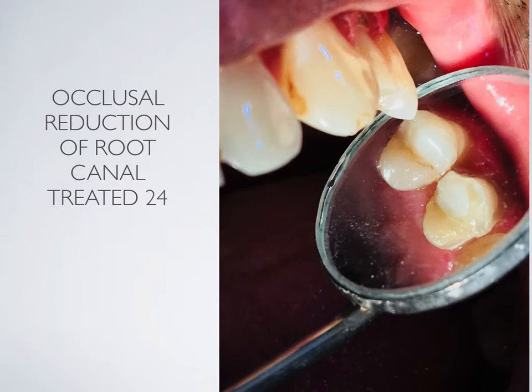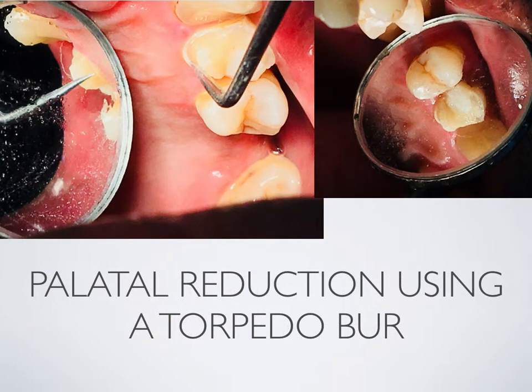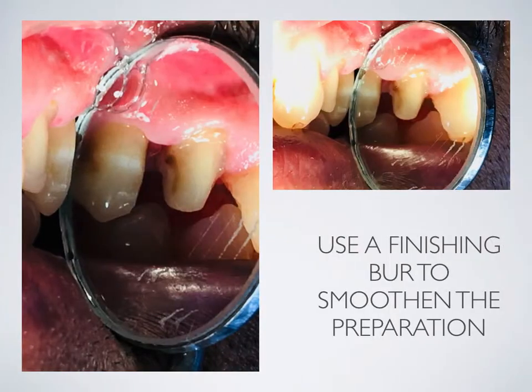The occlusal reduction of a root canal treated 2-4 can be done with a flat and tapered burr. The palatal reduction must be done with a torpedo burr. Proximal reduction is initially performed using a needle point burr to break the contact, followed by a winged preparation with a shoulder finish line meeting a chamfer finish line. Use a finishing burr to smoothen the preparation.